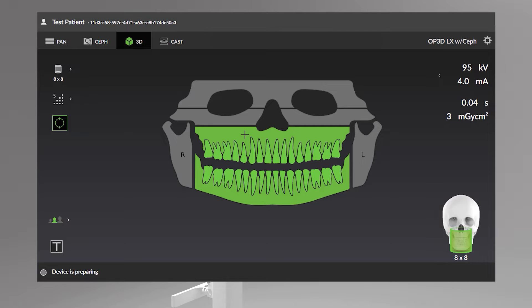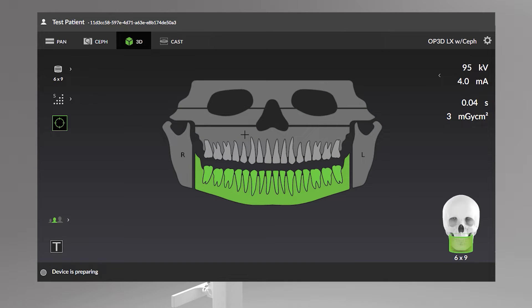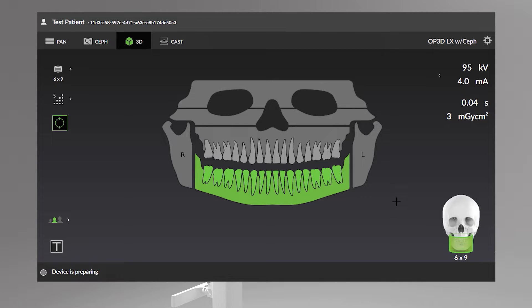You can select all parts of the dentition by double-clicking any single selection — tooth, jaw, or TMJ. Undo the Select All by double-clicking the selection to return to the previous state. Clear all selections by clicking the gray area on the lower corners of the dental chart. Undo the Clear All by double-clicking the gray area to return to the previous state.